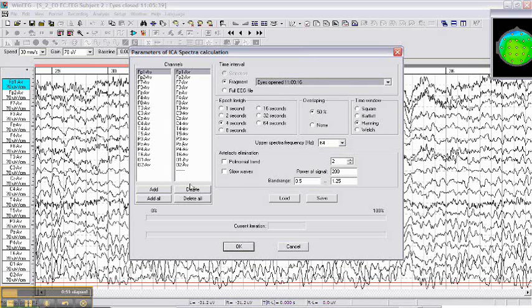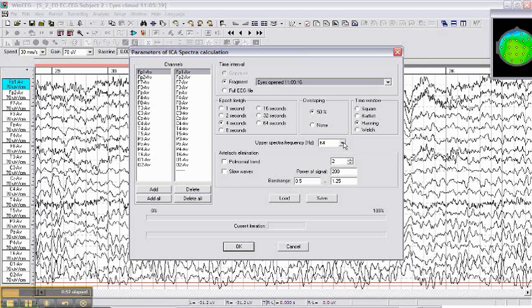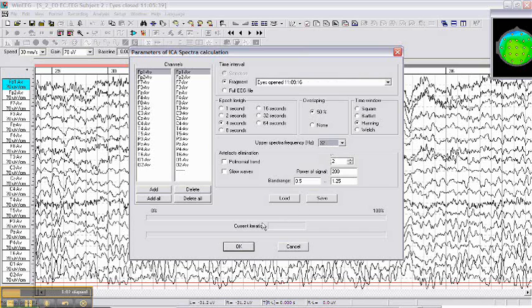You can make the upper spectra frequency less than 64 Hz, which actually doesn't matter. And then we just click OK.